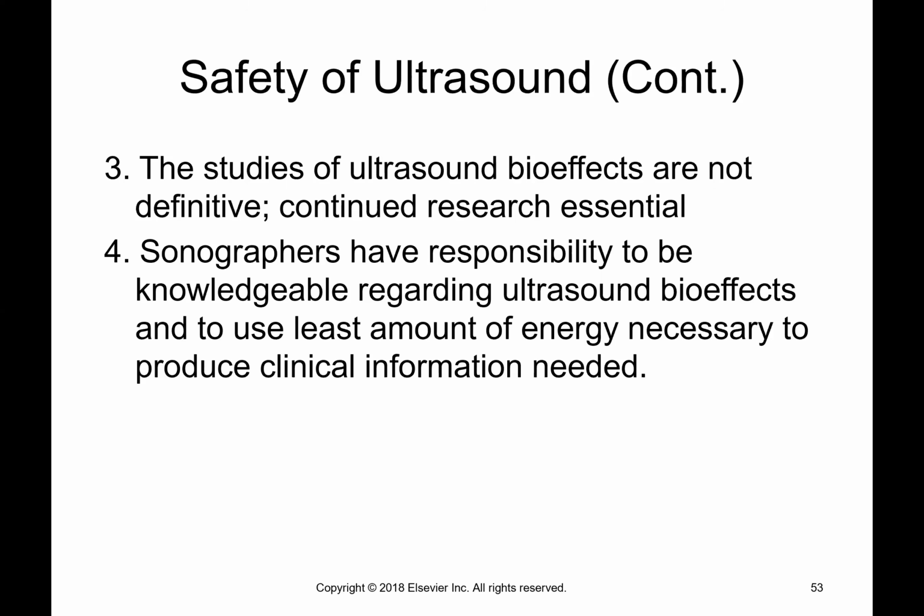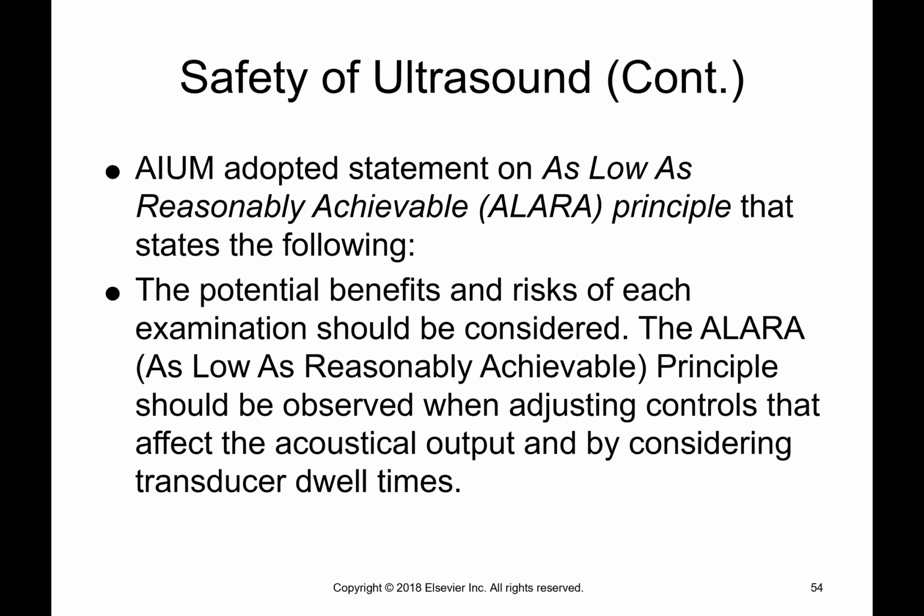So it's our responsibility to have knowledge regarding ultrasound bioeffects and to use the least amount of energy necessary to produce clinical information. We call this ALARA, as low as reasonably achievable. The potential benefits and risks of each examination should be considered. The ALARA principle should be observed when adjusting controls that affect the acoustic output and by considering transducer dwell time.